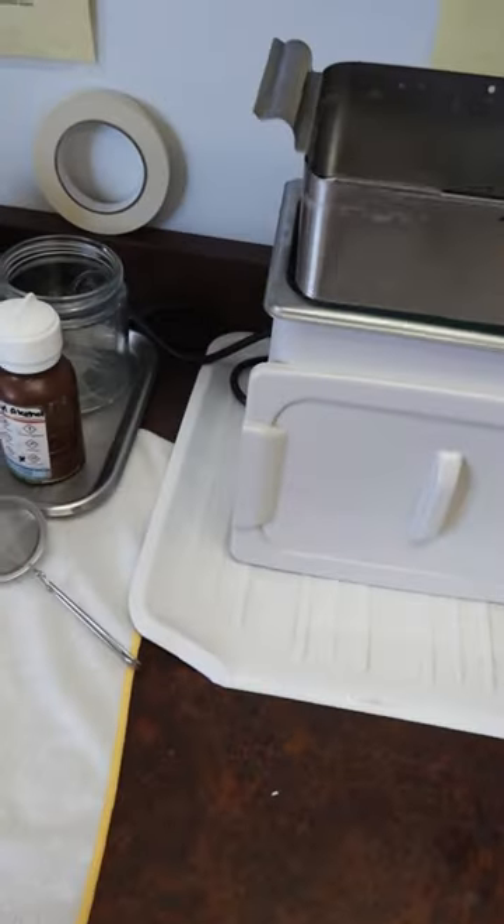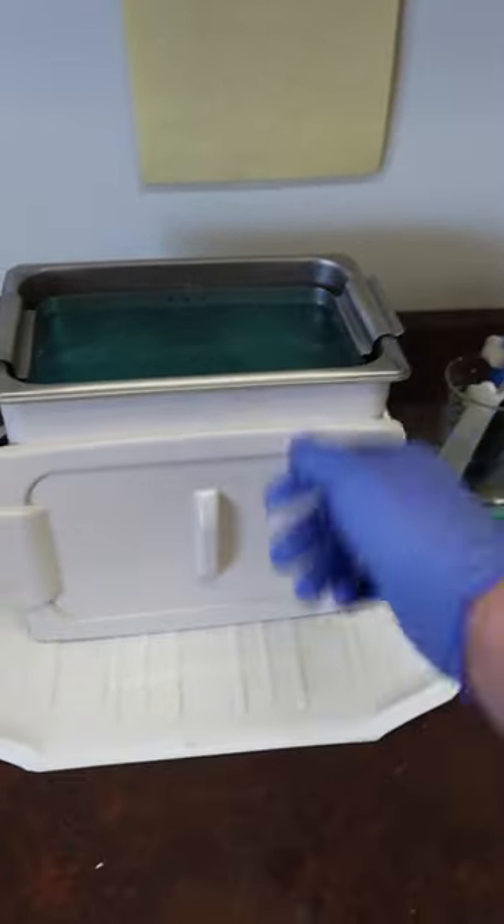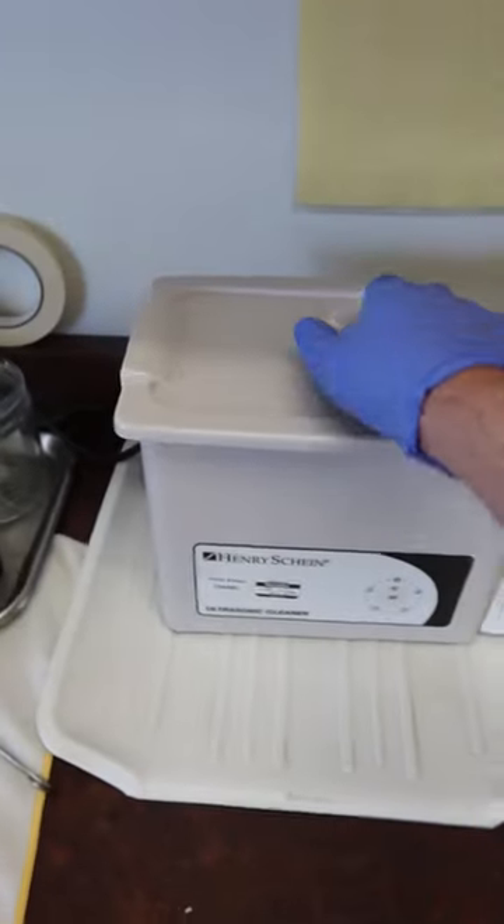Put the basket back in and wait for the next load — or go ahead and start the next load. Put the lid back on and we are ready to go.